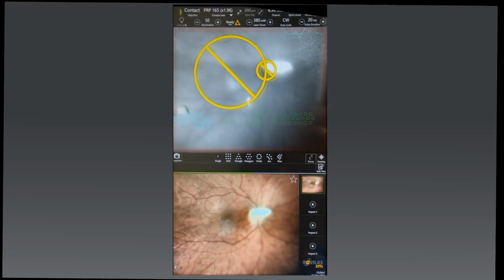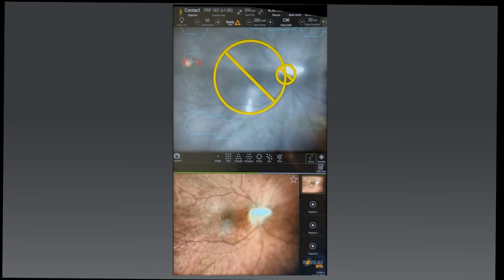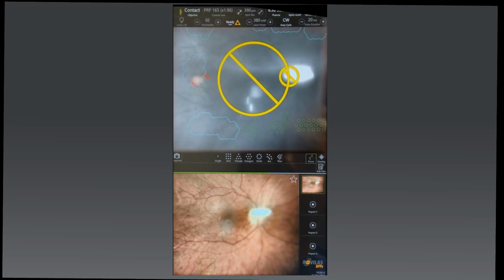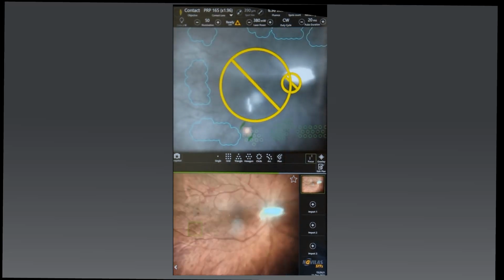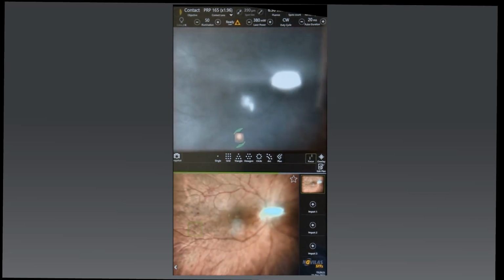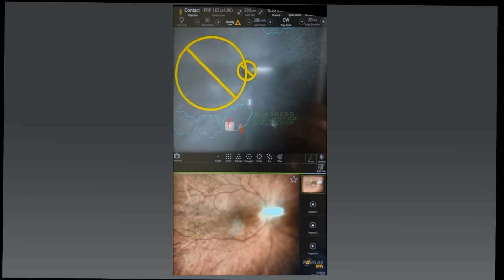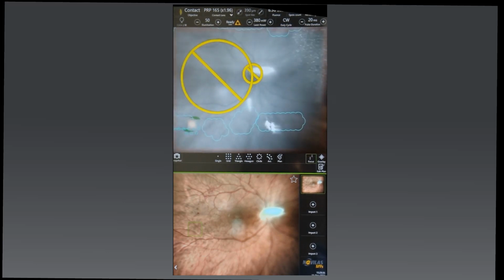And this patient had multiple treatments in his fellow eye. Yeah, that's right, Julian. So this patient had multiple small sessions of pattern laser in the other eye, different system, but did struggle with it. So we had to keep coming back, which in the ophthalmology clinic is an issue, because with capacity issues there's quite a high risk of patients being delayed. Thankfully, he wasn't, and we did manage to complete his treatment, but it took a long period of time.